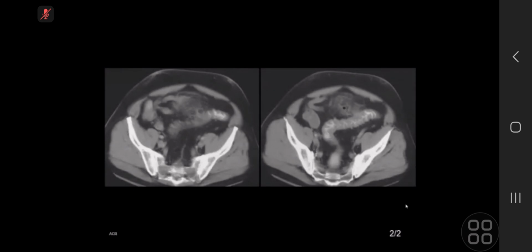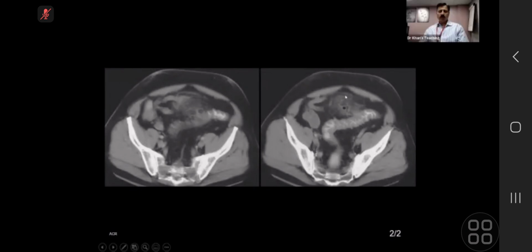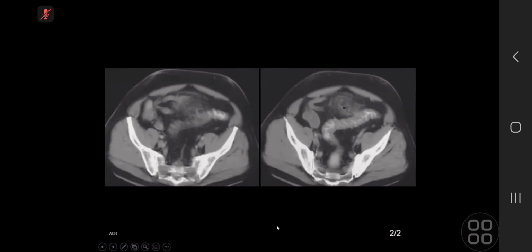I would check the rest of the CT to look for any other extraluminal gas. The patient needs to be referred to general surgery urgently. So what will be the management for this kind of finding? They may choose to manage it conservatively with antibiotics if it's just a single locule, and see if it resolves conservatively. Okay, fine, good.